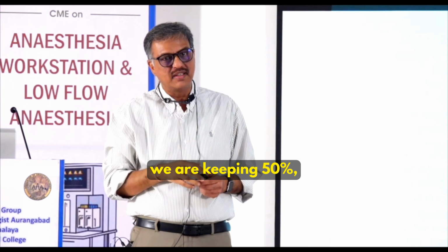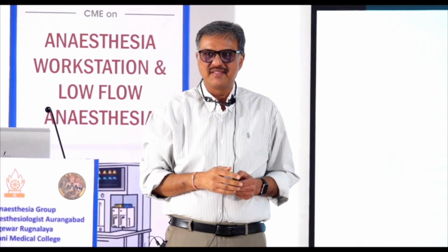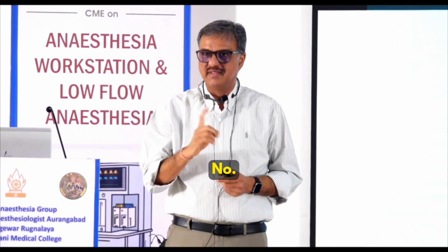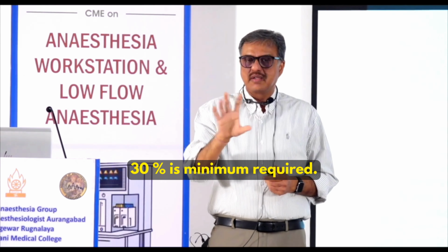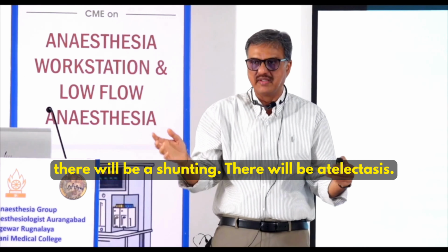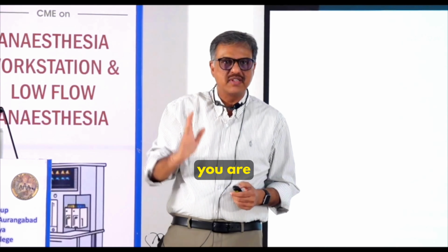Under anesthesia, we are keeping 50%, 60%, 70%. Is it required? If you can maintain 98 on air, the patient does not need that much. So you are overdosing. 30% is the minimum required. Why 30%? Because under general anesthesia there will be shunting, there will be atelectasis, and that needs to be compensated. That is the reason we increase it a little and bring it to 30%.